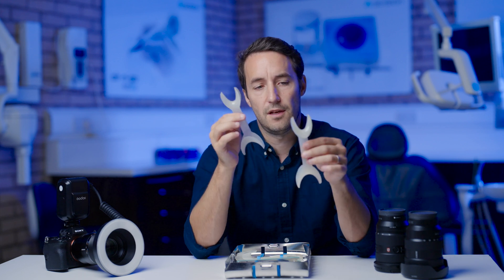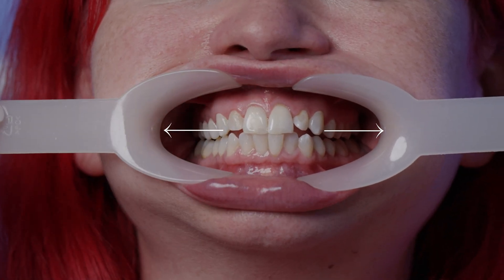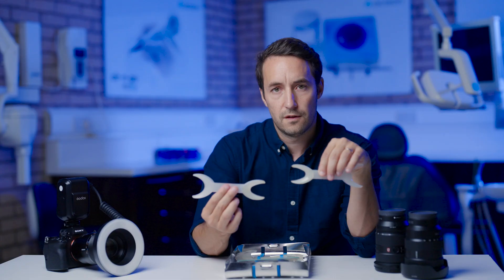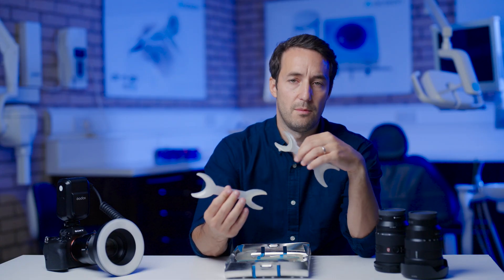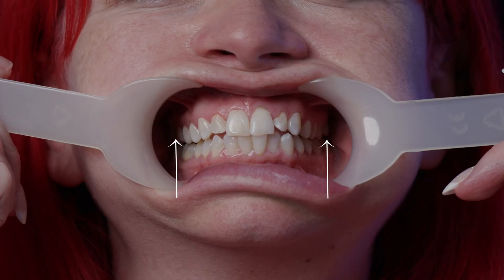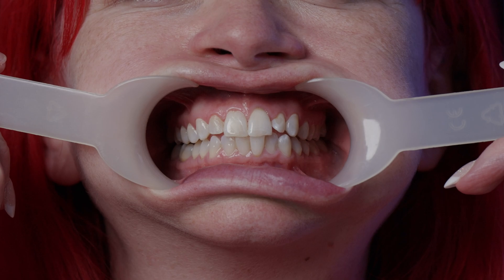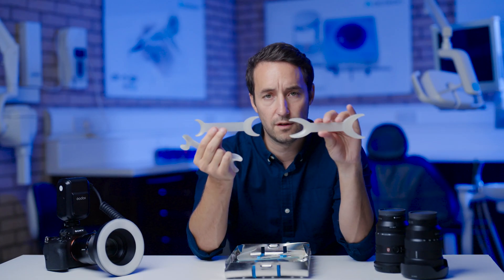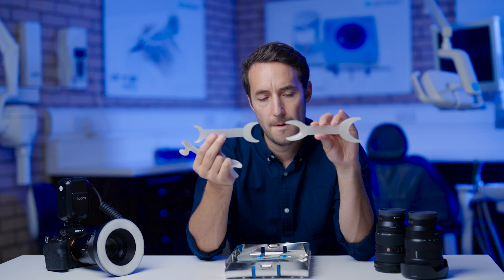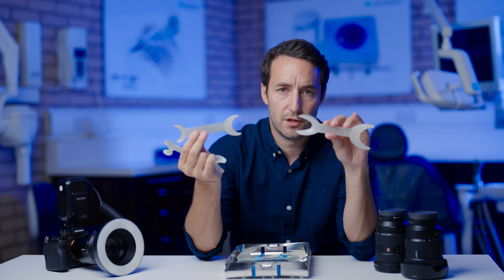What you'll note is the shape of these retractors lends more to a horizontal retraction rather than vertical. So if you're demonstrating the gingiva or buccal and require more vertical retraction, you'd be better off using retractors that offer more vertical retraction. When you look at them together you can see the difference, so you're picking your retraction based on what you're photographing and what you're trying to achieve.